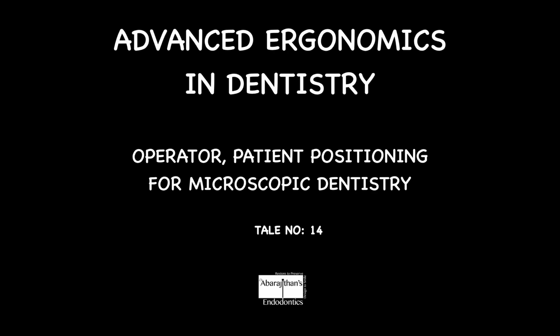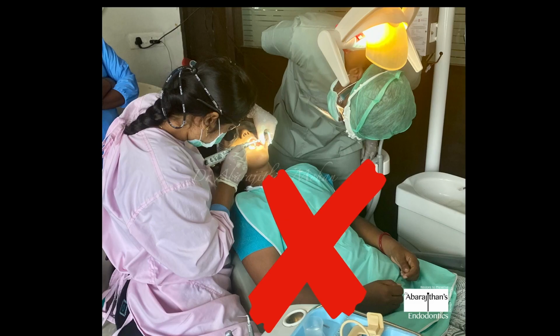In this demonstration, we'll be talking about the operator and patient positioning for advanced ergonomics in dentistry. So this video will be especially useful for people who are already using some form of magnification in their practice, especially microscopes.